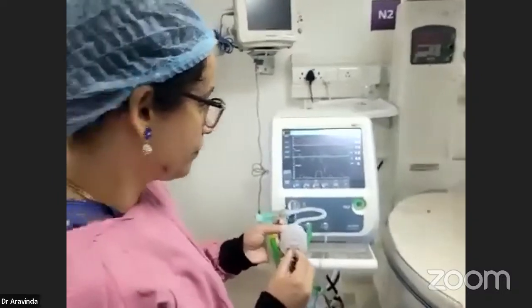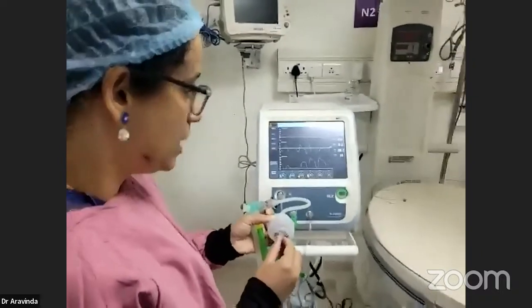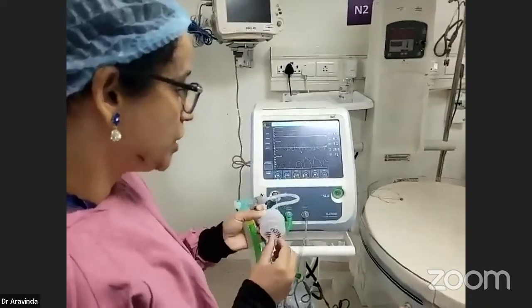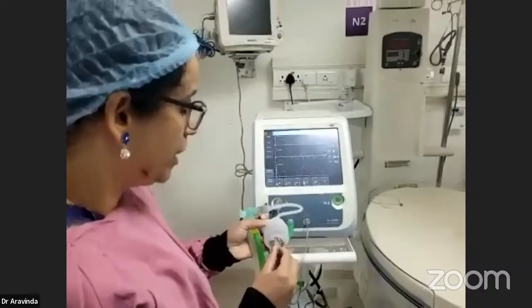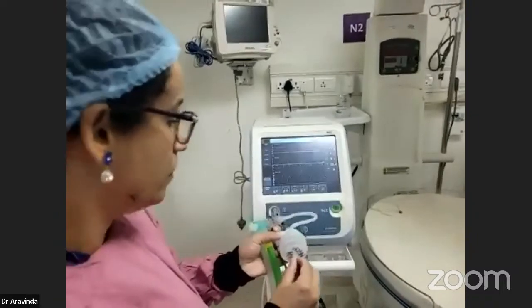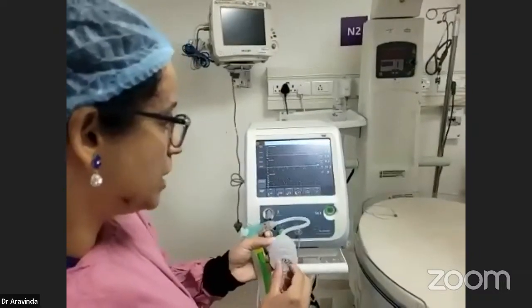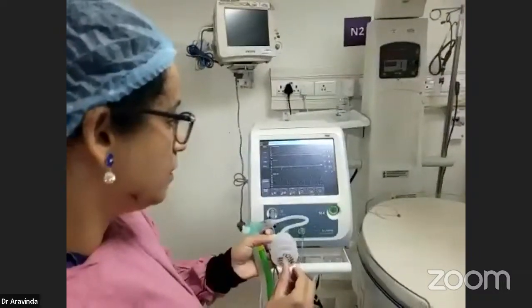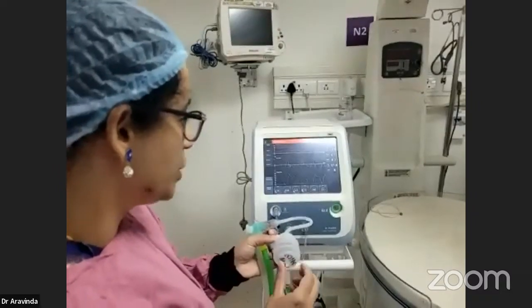If the baby is breathing, you can see the orange line, and because it's SIMV mode, the ventilator is trying to give the breath at the same time. With this, you can assess how many breaths the baby is taking and assess the readiness for extubation.